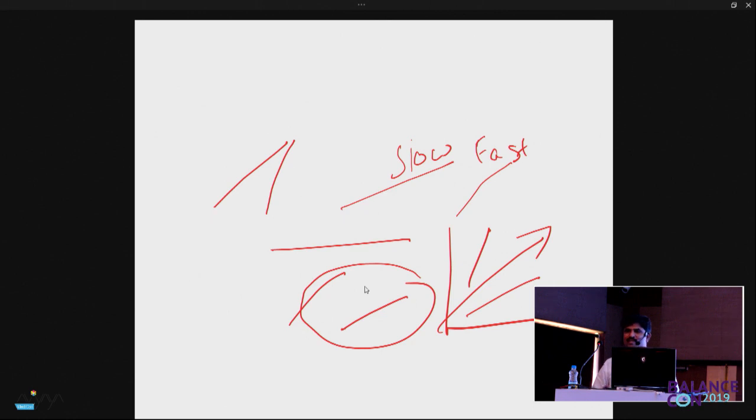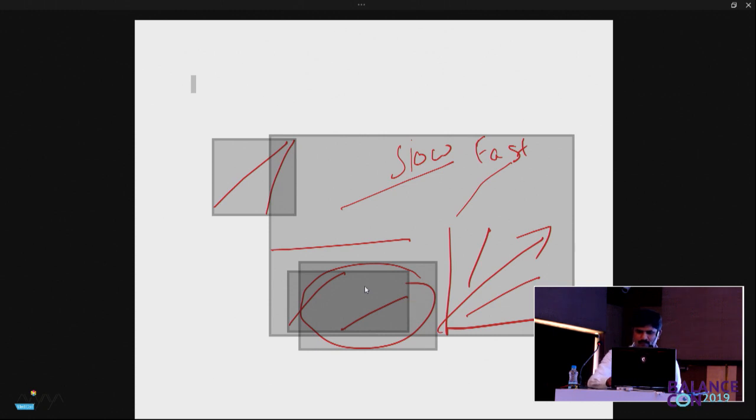Now, once we know these 3 alphabets, we can know whether the eye is in one place, whether the eye is moving, whether it is moving fast, whether it is moving slow. Based on this we make up the words. First is alphabets, then the words. Then we form sentences. So let us go to the words.